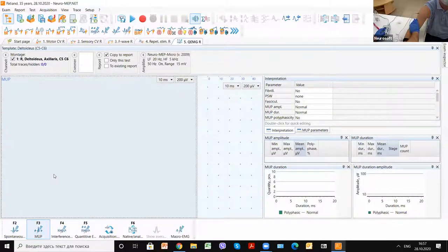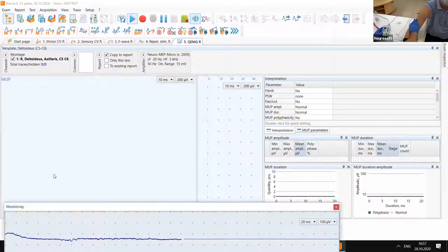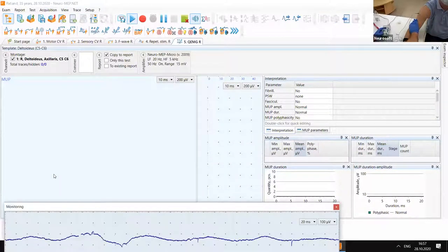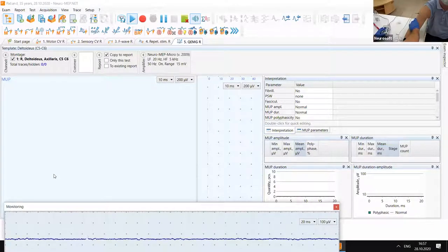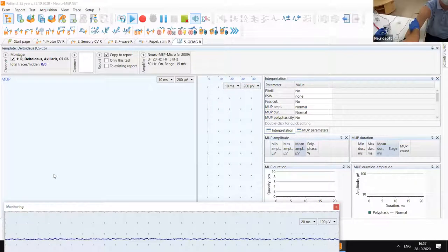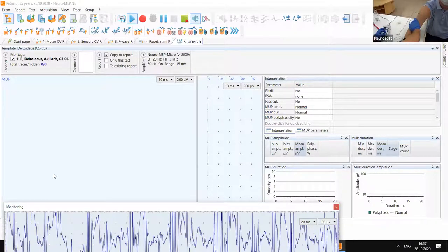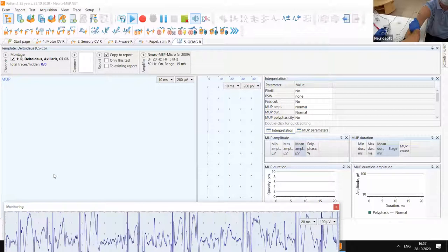We will use automatic seeking of the potentials. Please, tense a little, a little less.